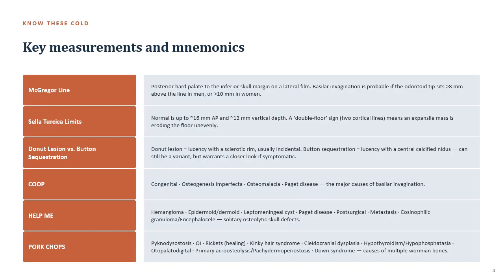So they basically draw a line and look to see how high the odontoid sits in relation to the base of the skull. The next one is the sella turcica. It's like, if you already did your skull and procedures and went over anatomy, it's a small depression in the sphenoid bone area. That is the location where a pituitary gland sits.